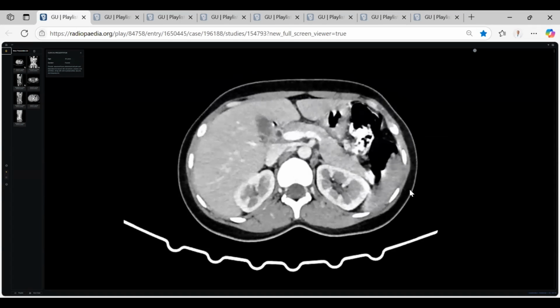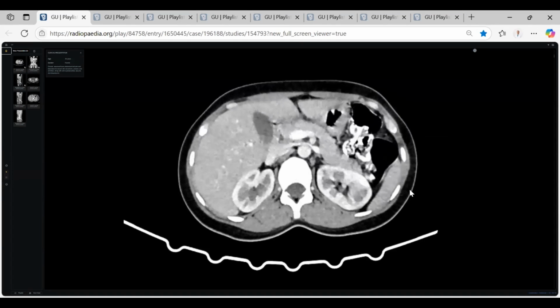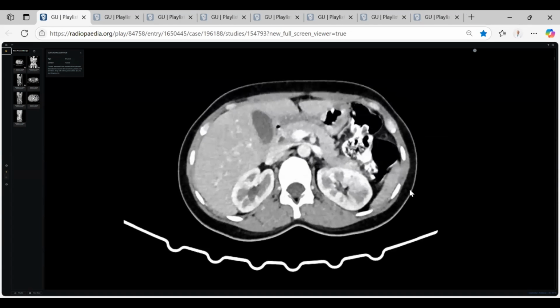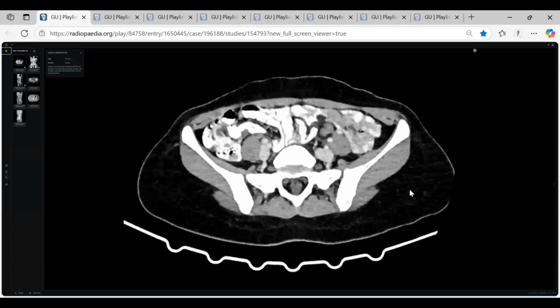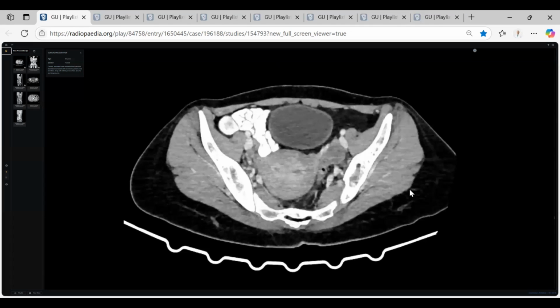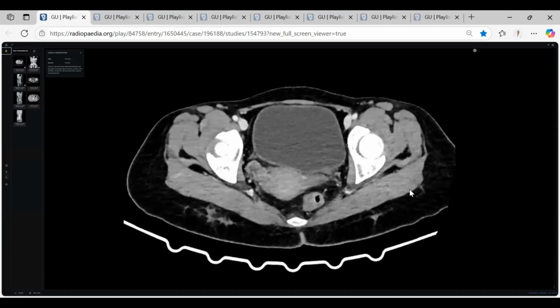So, my advice for all of you, you should track the CT or the MRI sequences from the top till the bottom. Very critical. This case, you must not miss; it is an easy case if you follow the proper technique. Thank you so much. Next candidate.